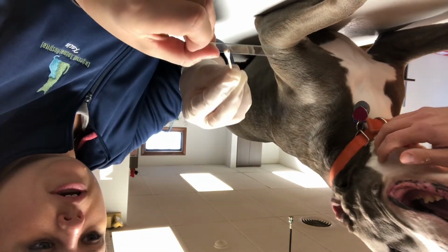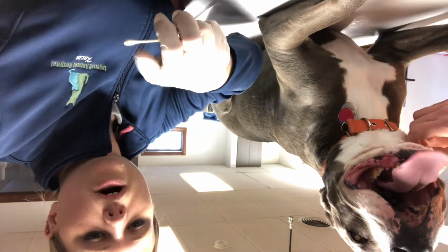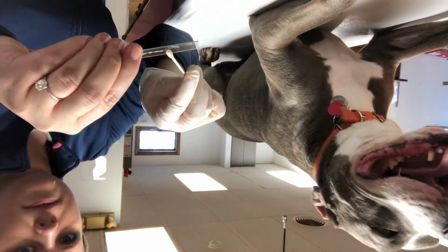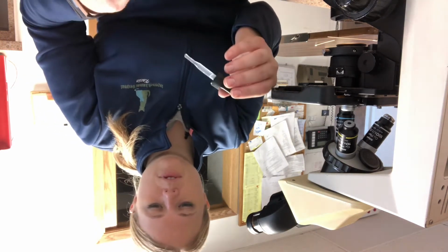Ideally doing 2 per ear is best. That way we have 2 microscope slides. One would be unstained and one would be then air dried and stained. For our ear swab samples, I've got 2 slides per ear. This slide here is what I have from the left ear. I'm going to fix one with mineral oil and then place a cover slip over top.